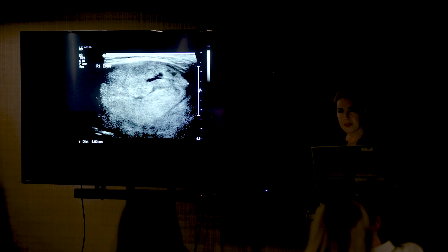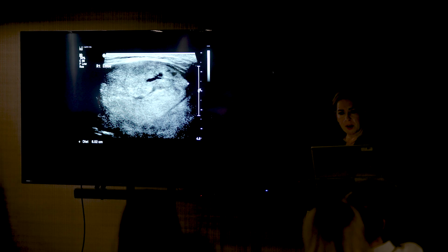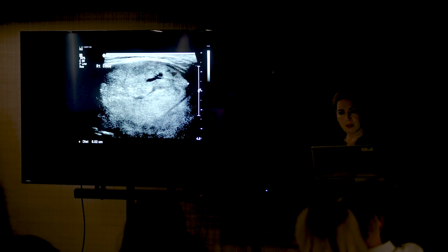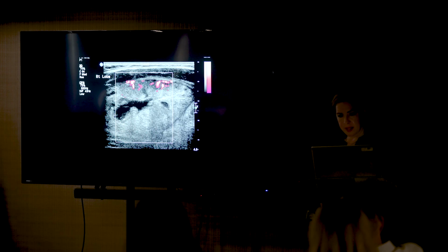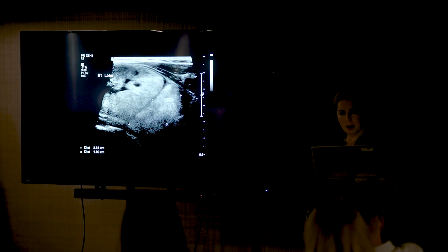Case 6, in fact, I'm going quick, maybe I'll get through them all. Just wanted to show you lots of pictures. So case 6, this is a larger nodule here. I haven't put the age of the patient there. So what grade would you give this? Which U grade? And would you put a needle in or not is really the crux of it. So there's some vascularity there as well. And you can see there peeping in the edge, there are further nodules adjacent that look very similar.